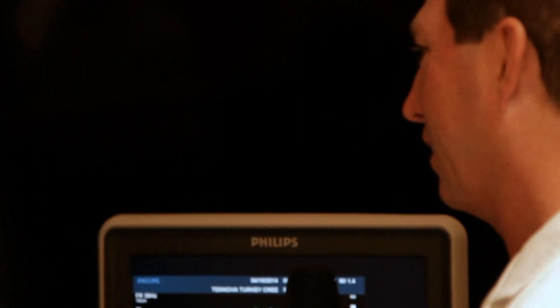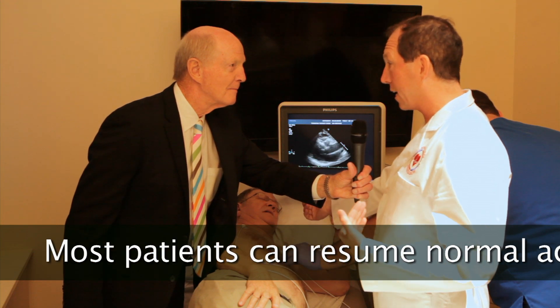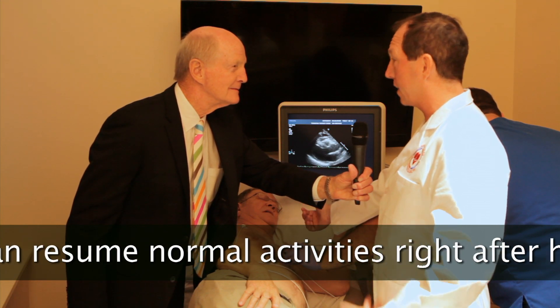Now could you just walk down and do this in the abdomen and the legs and everything else? We can. We can do ultrasound of all the blood vessels — believe it or not, even from within the brain, the neck, the heart, the kidneys, down the legs.